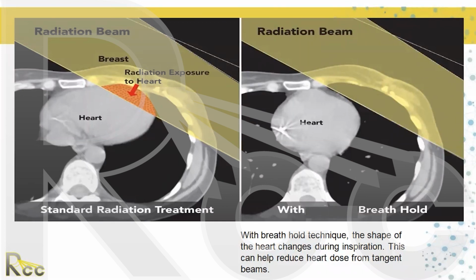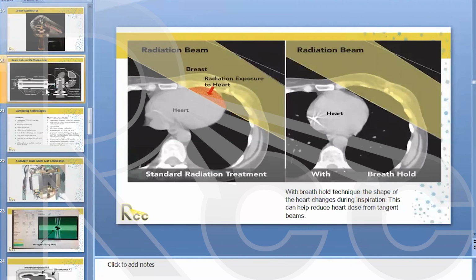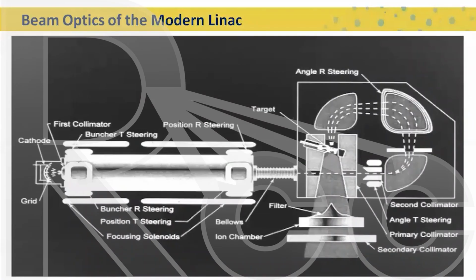One of the principal advantages of the TrueBeam is that it's capable of very, very high dose rates. So TrueBeams typically operate at over 1,000 centigray per minute. Now with a TrueBeam machine, you can remove the flattening filter. So remember we saw, let me go back here. Okay, now, from the current slide. So, okay, here's the flattening filter, this cone right here. On a TrueBeam machine, you can take that filter out.